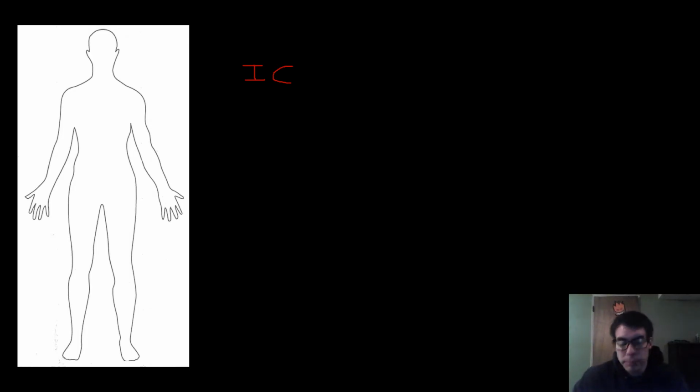So V1 is going to go right there. V1 is located at the 4th intercostal space, and I'm just going to draw an R for right.